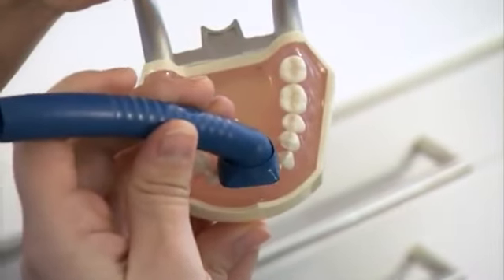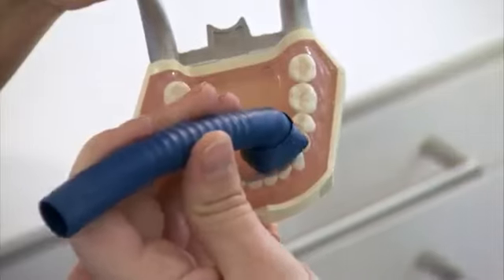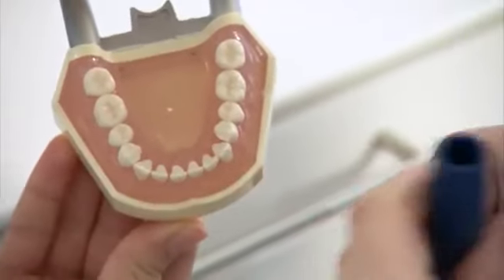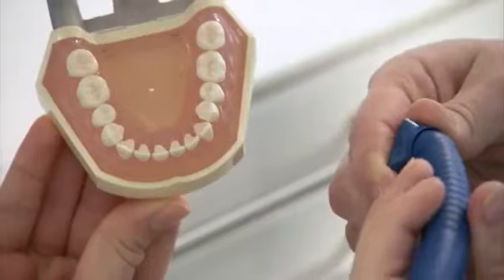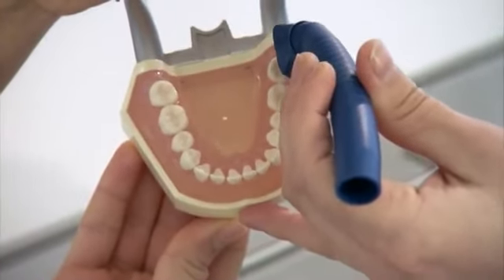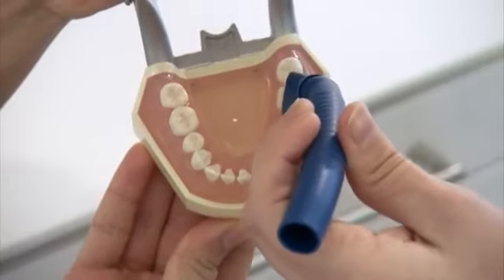When switching tooth quadrants, the flexible protective shield is turned and set to the appropriate position, thus ensuring the continued optimal aspiration of aerosol. The flexibility of the shield helps to adapt to the ideal aspiration position when switching from lingual to buccal.